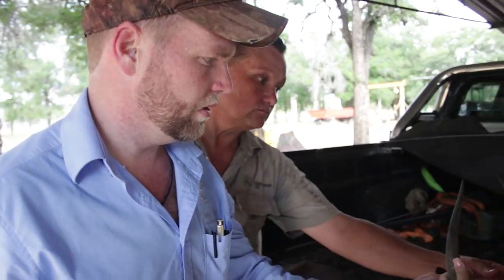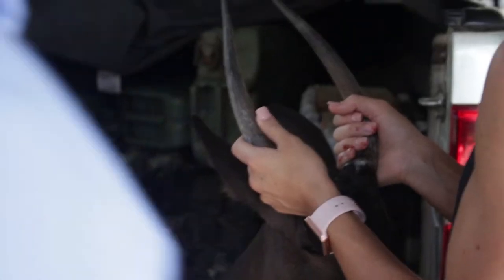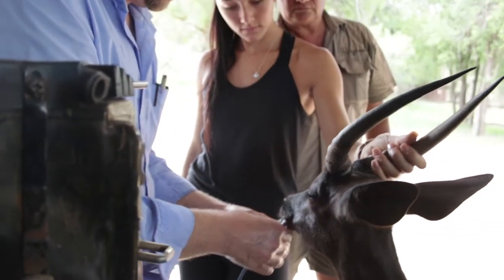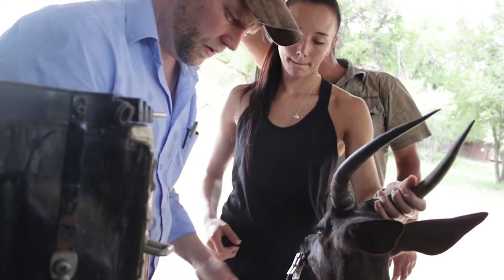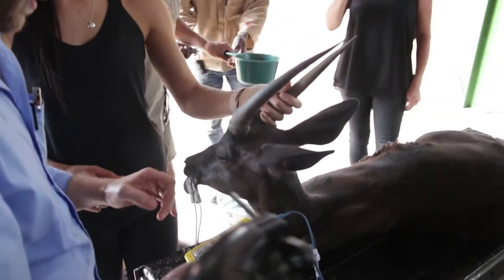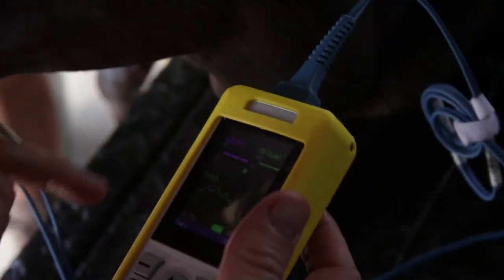That's why you get that sort of spongy feel underneath here. If it stands up nicely like that then it's normally fine - the minute they start to drop like that, then you know something's wrong. You can see they're standing up nicely. This is the pulse oximeter and it just has the heart rate.